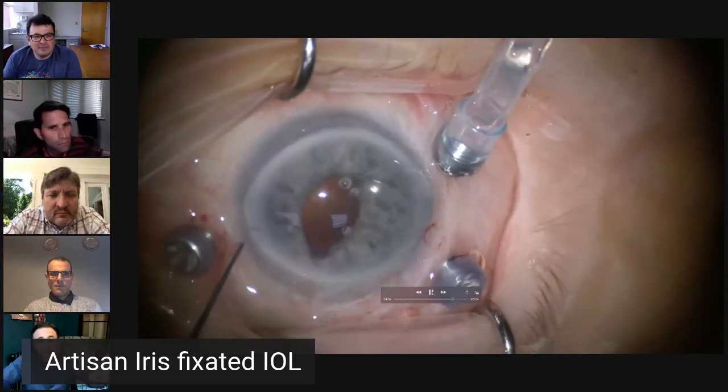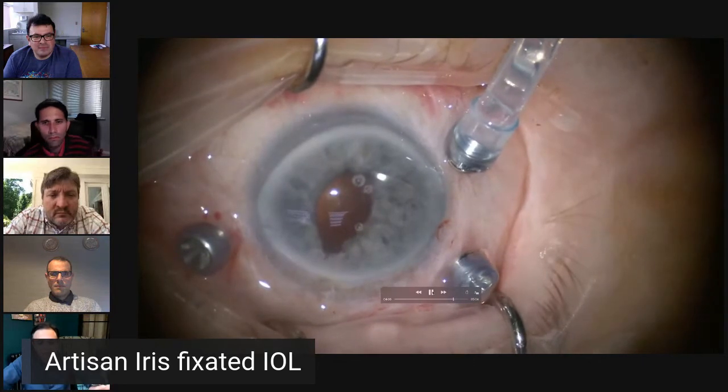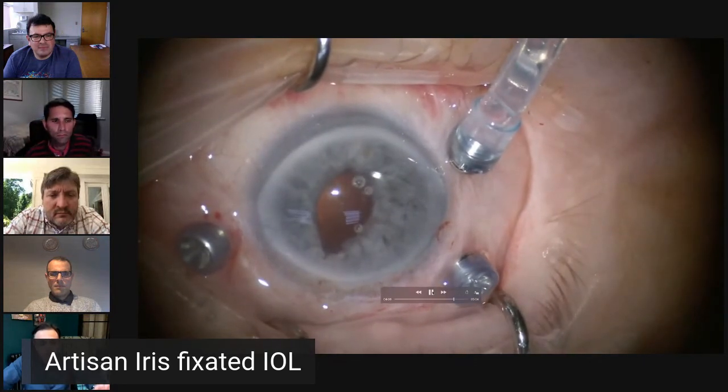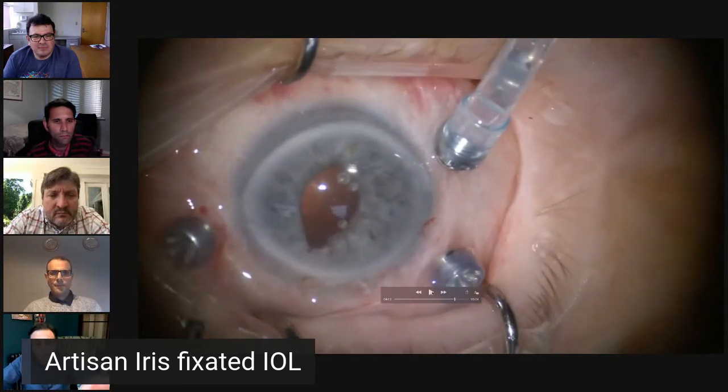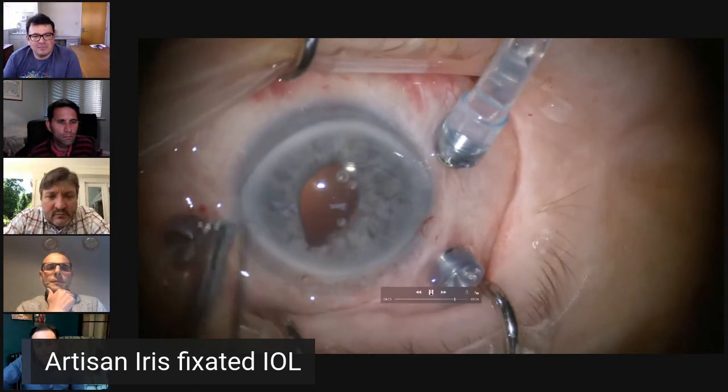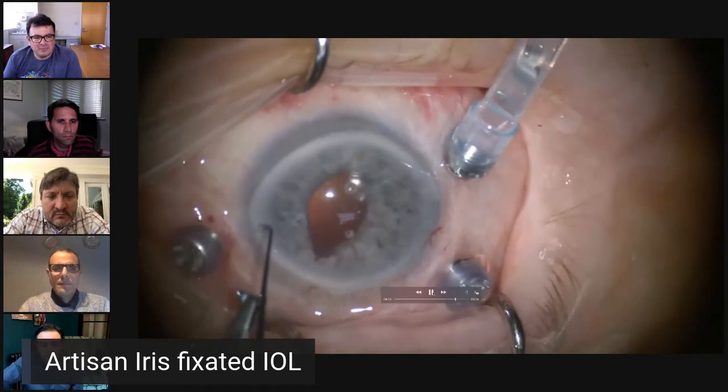All this sometimes seems very simple, straightforward, and believe me, the first few cases you struggle, but it comes with experience. Once you have hooked one of the haptics in that position, make sure that you don't drag the lens to the side or to the other. That's where the other haptic will need to be clipped to make sure that you get as round a pupil as possible.